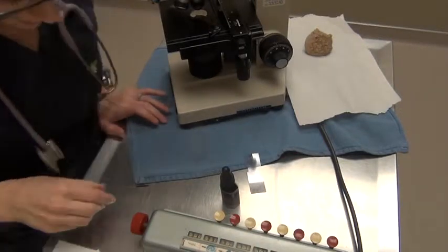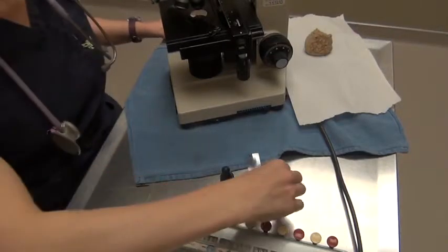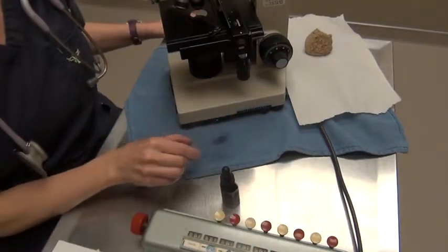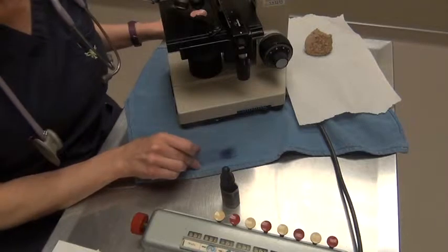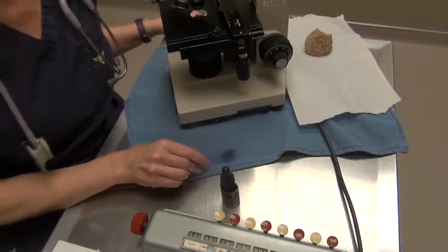Hi, it's Leslie Schmidt. Today I'm going to be going over evaluation of a blood film or a blood smear. We're going to do this to differentiate our white cells. We're going to describe the morphology of our red cells and perform a platelet estimation.